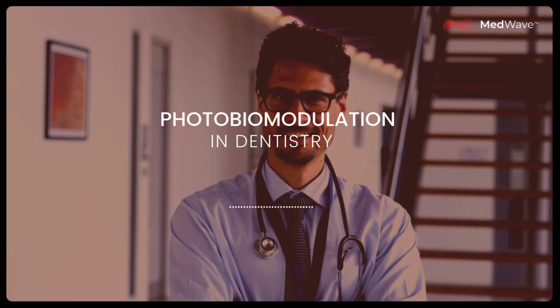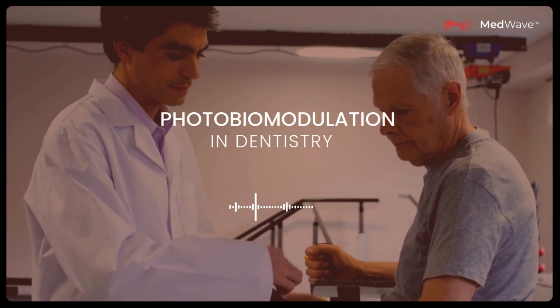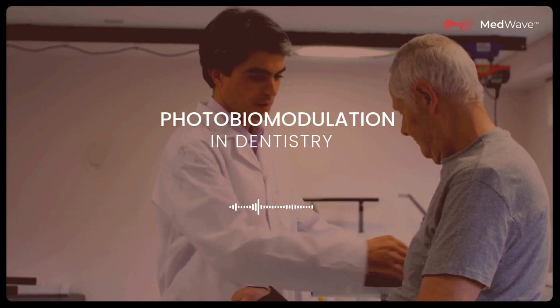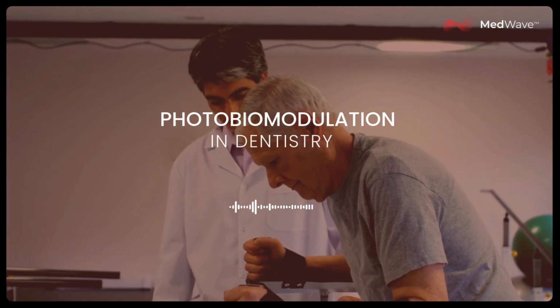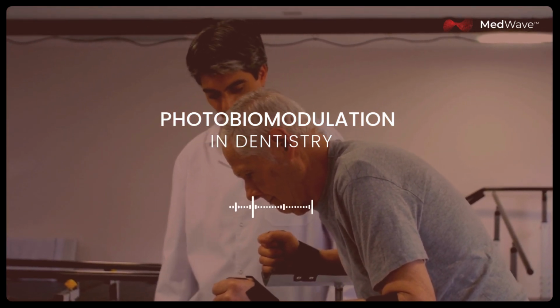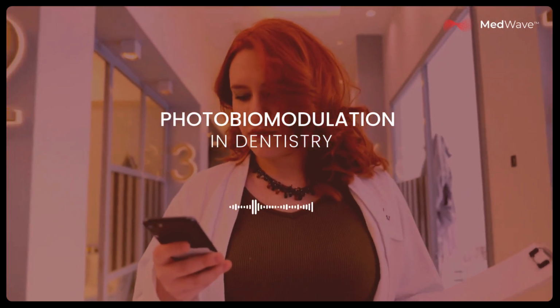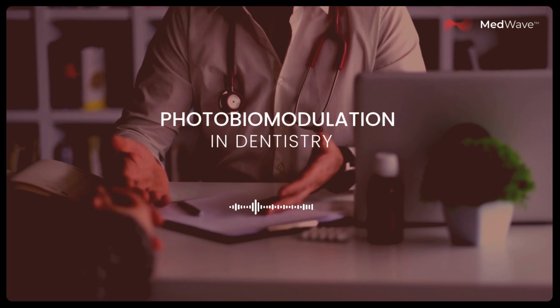Absolutely. And it seems like this approach could be a real game changer for gum disease as well. You were talking earlier about how common it is, and I know a lot of people struggle with the traditional treatment. Absolutely. Another study focused specifically on treating periodontal pockets, those little spaces that form between the gums and the teeth. They're a key indicator of gum disease. This study used a dual wavelength diode laser, specifically 810 to 980 nanometers, and the results were really promising. What did they find? They found a significant reduction in both pocket depth and bleeding in the group that received the laser treatment. Less bleeding, shallower pockets. What would that mean for someone dealing with gum disease day to day? Well, it could potentially translate to less invasive treatments, fewer surgical interventions, and a better overall prognosis for managing their gum health.